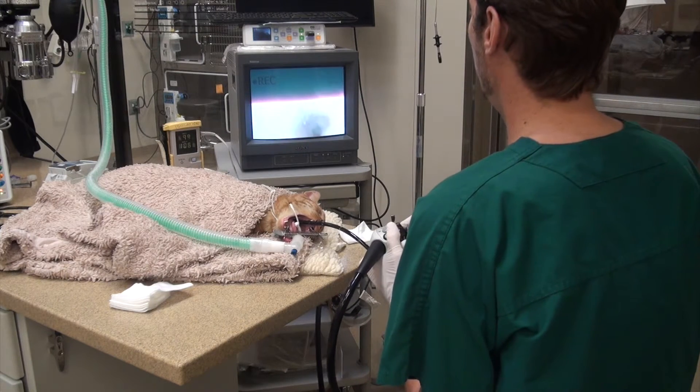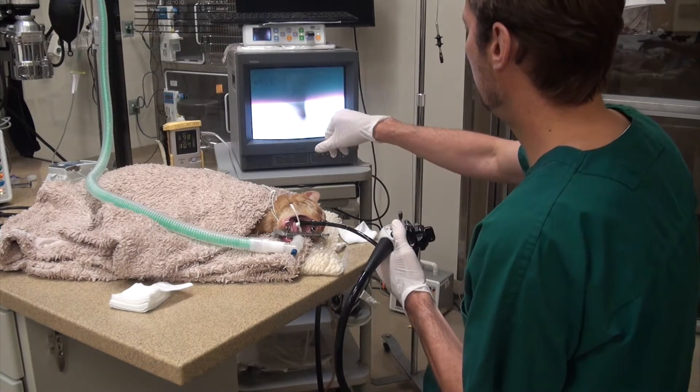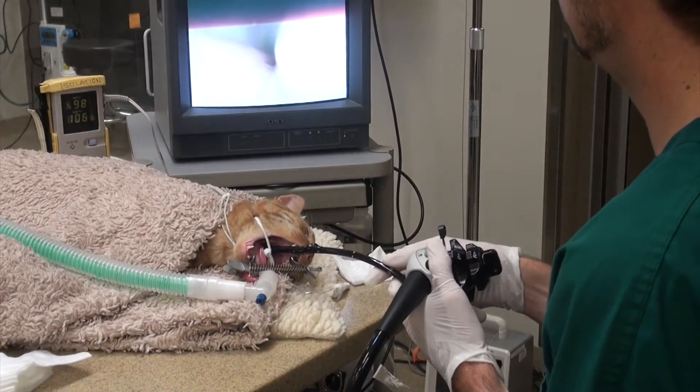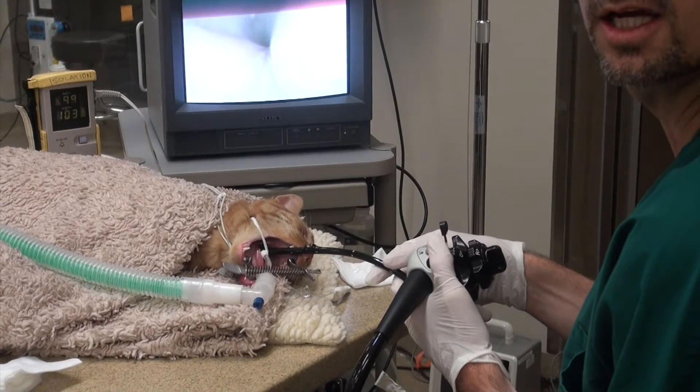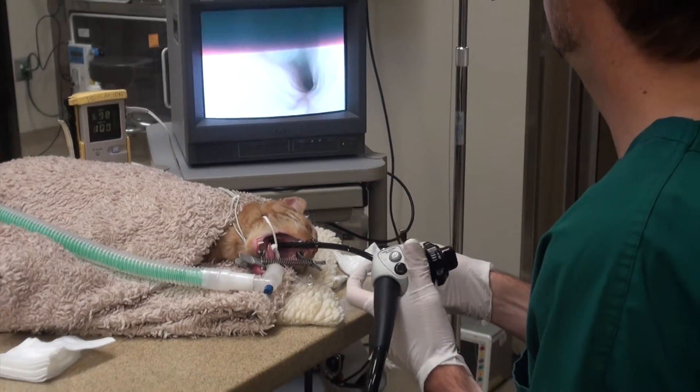Right now, I don't know if the camera's showing this, but we're in the esophagus and you can actually see the heart beating right up against the esophagus there. Cesar, can you see the heart at all? Yeah, zoom in a little bit. Okay, so now we're going through.